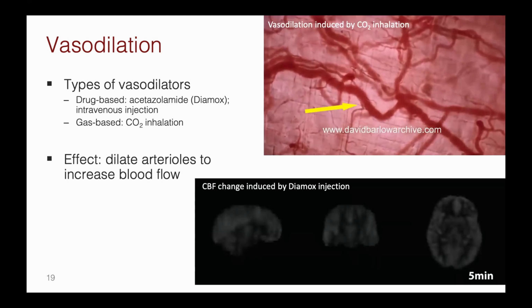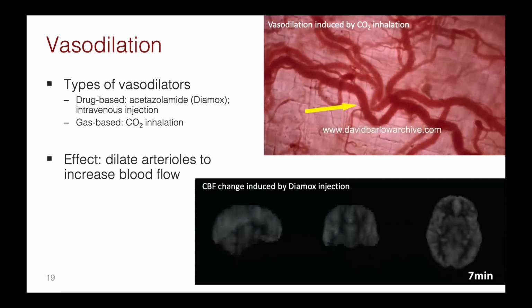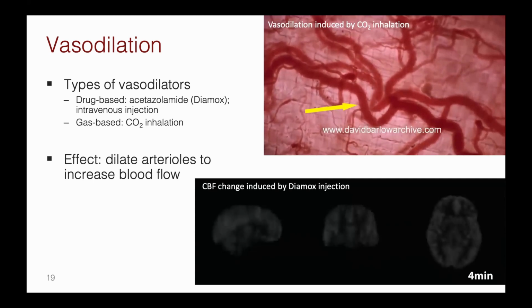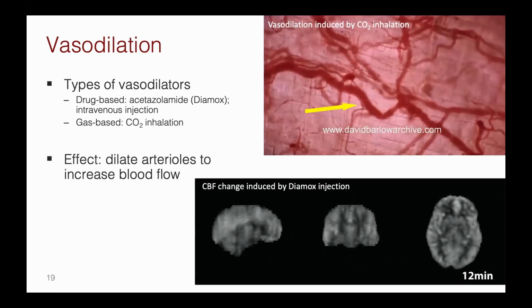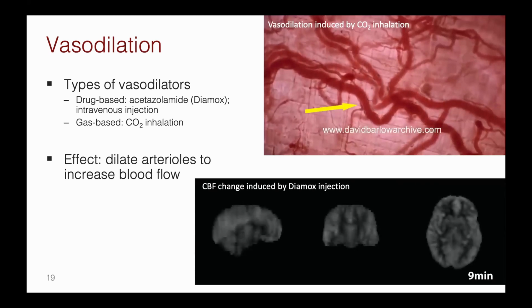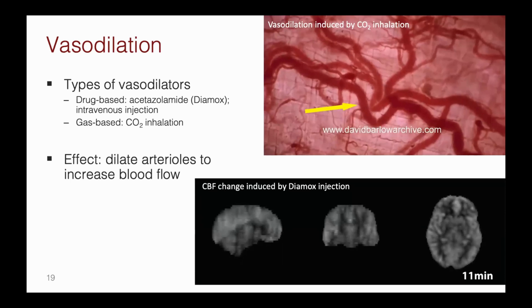And another approach is simply by asking our patients to inhale hypercapnic gas, or perhaps hold their breath for a period of time. However, this is more challenging due to the requirement of having a separate gas delivery system, or introducing some sort of discomfort to our patients. But in essence, all kinds of vasodilators target the enzymes in the metabolism of CO2 to relax the smooth muscle cells on the walls of blood vessels to increase blood flow.